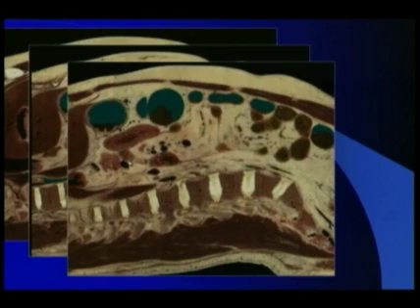If we go more left, you can see here the pancreatic body, or the proximal portion of the tail, and the kidney and stomach again. In the most left sagittal cut, we start seeing the spleen and a small portion of pancreas here.